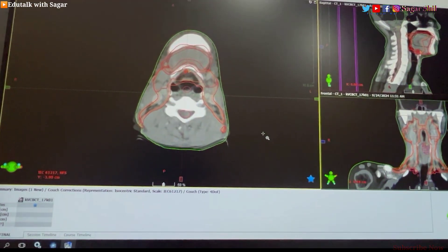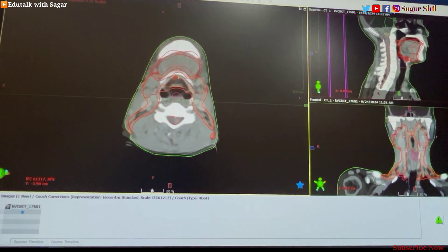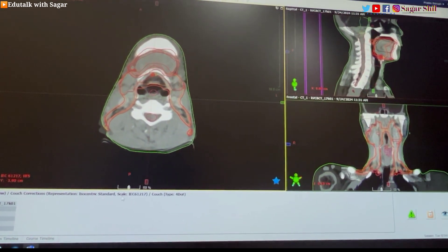Hello everyone, welcome to another video. In this video I am going to discuss about CBCT matching and how to match CBCT images in heterogeneous regions. I'm going to discuss everything about how to match CBCT images — what should we follow, what things should we keep in mind. I'll be showing a head and neck case as an example.